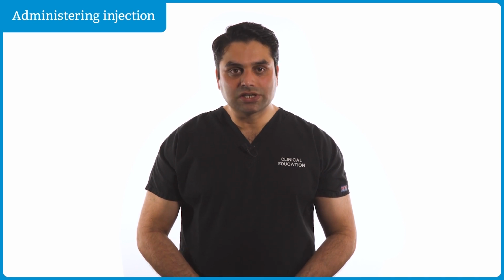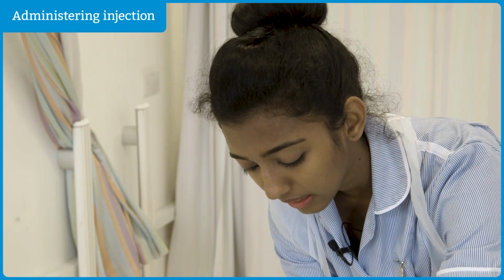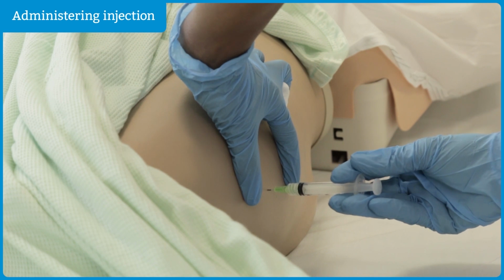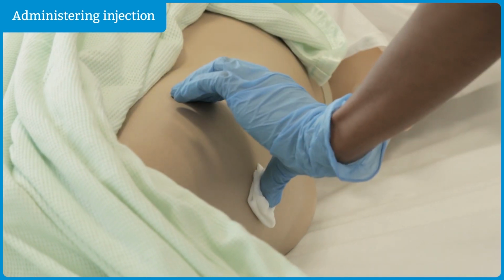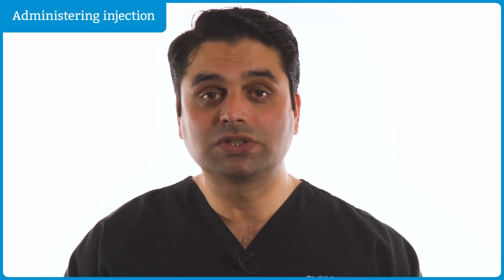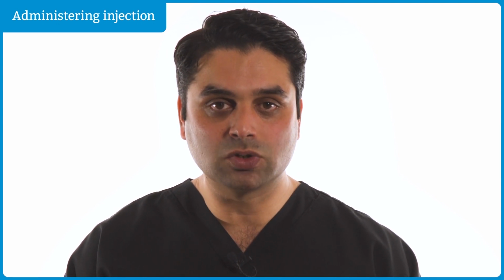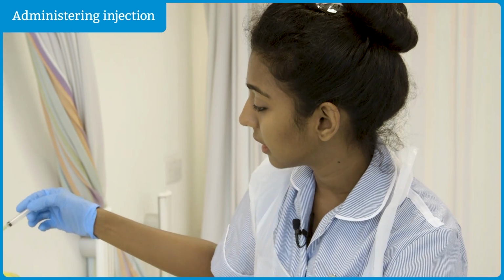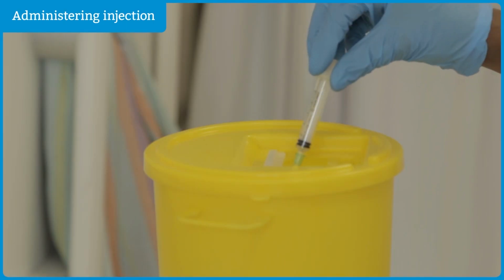Place the gauze over the injection area and dispose of the needle. So after ensuring that I've left the needle in for another 10 seconds, I'll be removing the needle swiftly, and I'll keep the gauze on the injection site, and I'll make sure that I do not rub the injection site. Always ensure sharp disposal safety, including the use of appropriate sharp disposal bins. And I'll be discarding the needle in the sharps bin after ensuring that the sharps bin is not full.